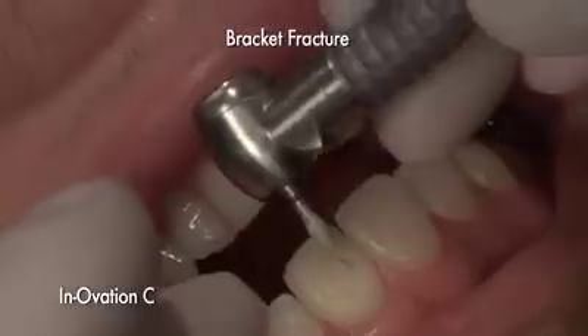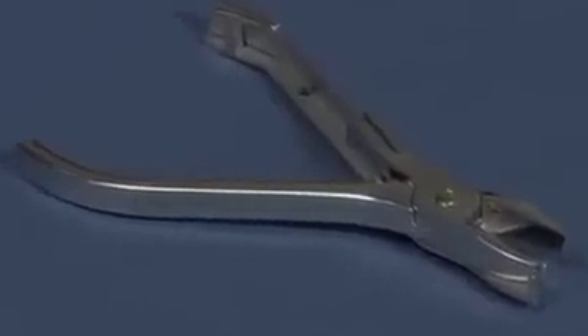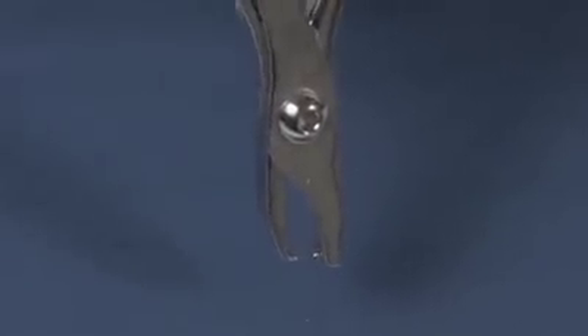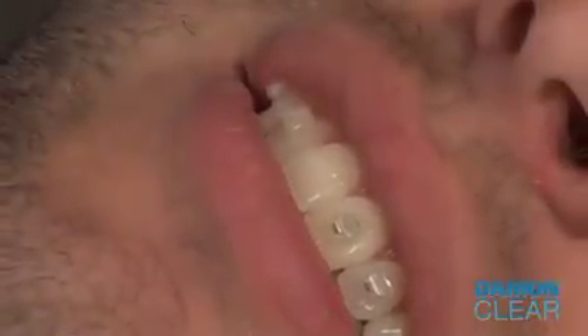Diamond burrs must be used carefully to prevent damage to the enamel. The Damon Clear debonding instrument helps to prevent bracket fractures. Its unique design ensures a safe and efficient removal process. The instrument's jaws and wedge are specially calibrated to the profile and base of the Damon Clear bracket, resulting in a fast, comfortable debonding experience for doctors and patients. No flash removal using a burr or scaler is required.